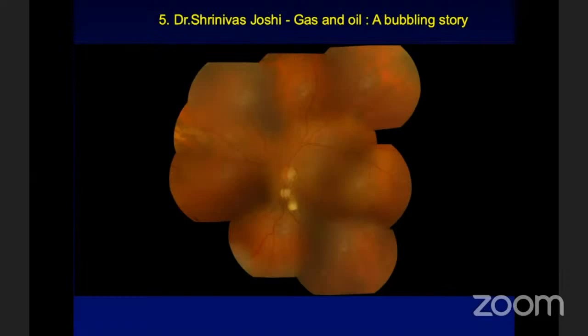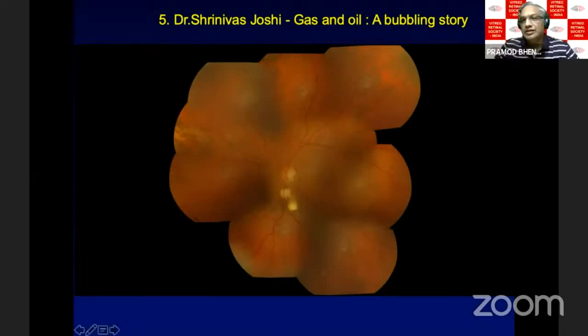Yeah, basically, there are two ways you can inject when you do pneumatic retinopexy. Once you put the needle, you ensure that the needle tip is inside, withdraw the needle a bit back, and then either you have one brisk injection so that you get a single bubble, or you can have a very continuous gradual injection, with the bubble at the needle tip slowly enlarging.